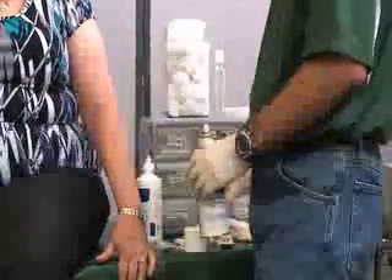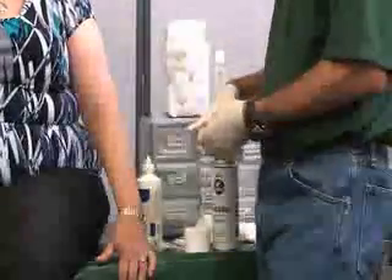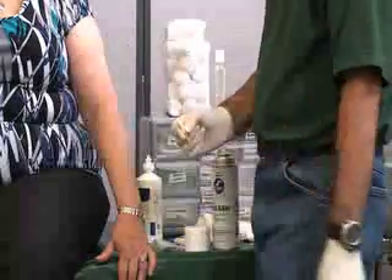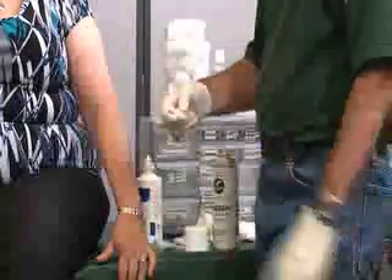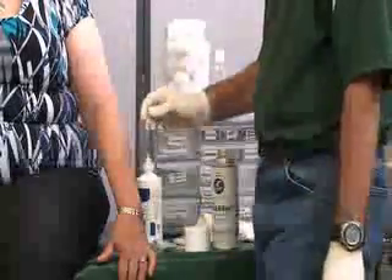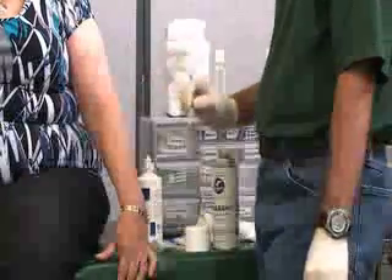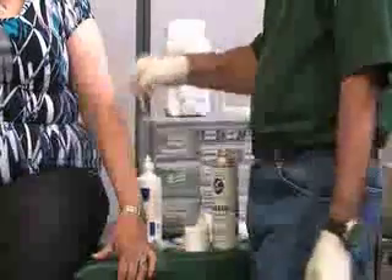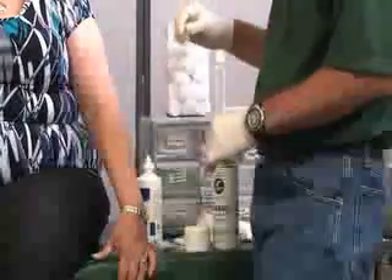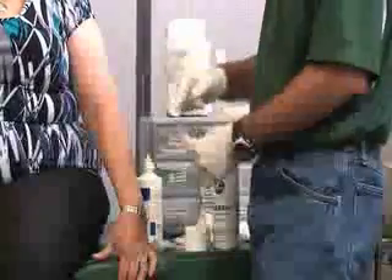There are two different methods we can use. We have something called a Stick-It capsule. With this one, there's a little dot in the middle — if you push the two ends together and break the seal, lift that end off and rub this on the edges. You can do this for any bandage, especially over a sweaty area. If it happens to be an area with some hair, we can always use a razor to shave it. This is like liquid glue — just make sure you don't get it on top of the wound.